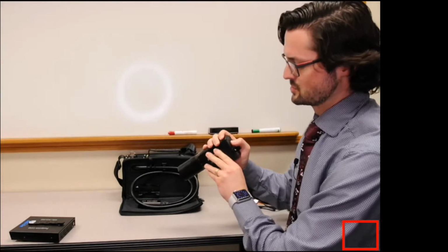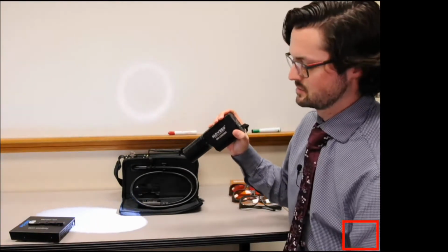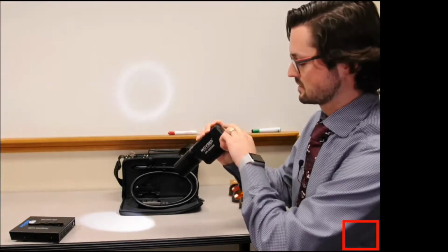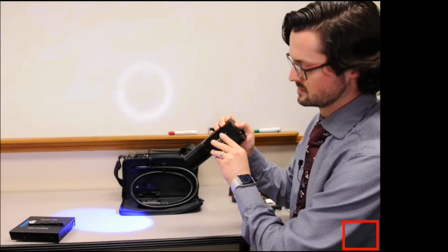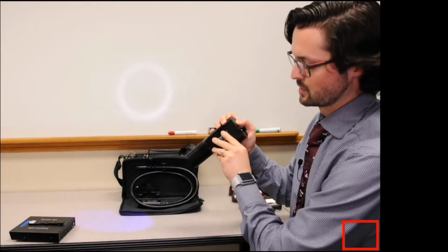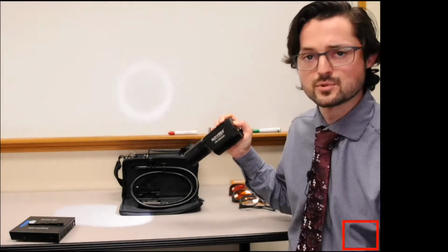So yeah, to turn it on, you just hold down the back button, or you click it a couple times, and then you start with your white light, a different color temperature white light, and then you can just click through your various excitation sources. So we have our green, our blue, our violet, our ultraviolet, and then the 2 different color temperatures of white light.